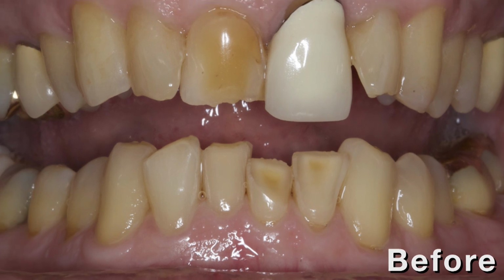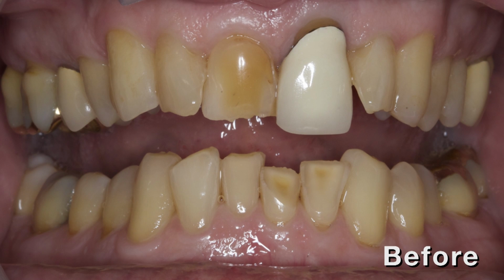Our plan for the patient is to restore these teeth with the very strong and also aesthetic BruxZir Anterior material. And on number 8, since there's some discoloration, attrition, and erosion, we will also place a BruxZir Anterior crown to match that of number 9.